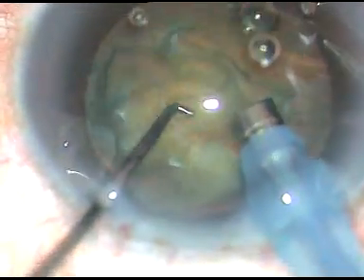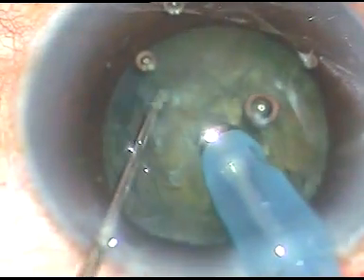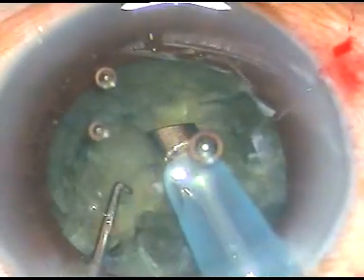Make a few sculpts, go to a deeper plane, and hold the nucleus with high vacuum and chop it. Go to position 3-3, bury the tip. Come back to FECO position 2 — that is aspiration mode — and chop the nucleus. Here again, hold the nucleus and chop it. See how easy it is. It is much easier than divide and conquer and stop-and-chop technique. Just make a few sculpts, go to a deeper plane, hold the nuclear mass at the center where it is most dense, and chop it.